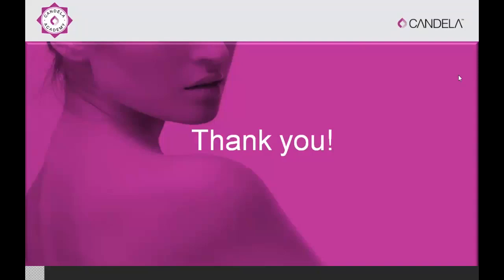Combination treatments. Yes, combination treatments, of course. Remember, the PicoWay does not necessarily need to be used on its own. So with melasma, for sure, you can combine it with topical treatments and/or tranexamic acid injections afterwards. In some patients I would combine that, and there is no concern. I would treat with the PicoWay and then inject the tranexamic acid afterwards, or you can combine with topical treatment. So combination with melasma is not a problem.